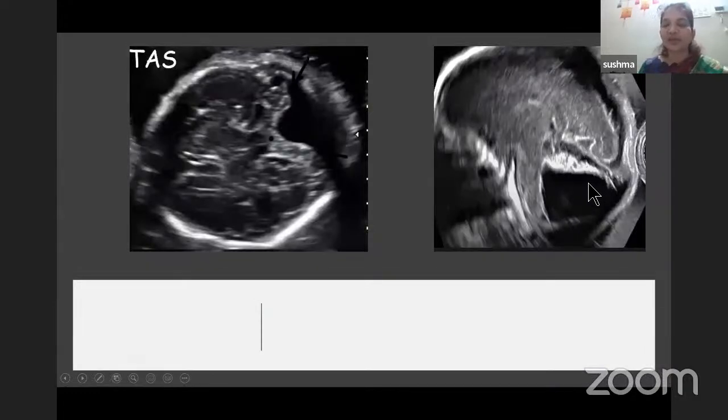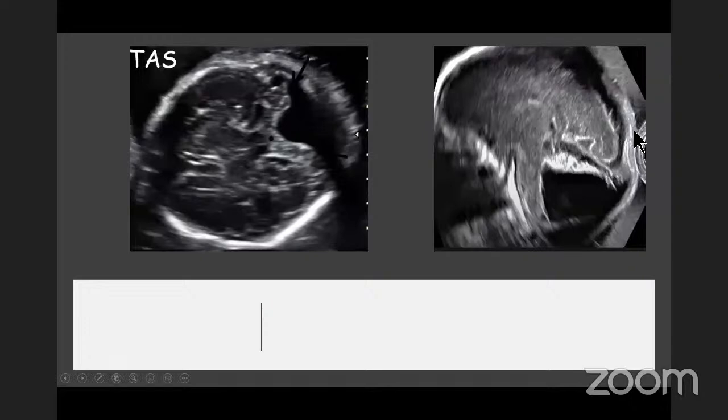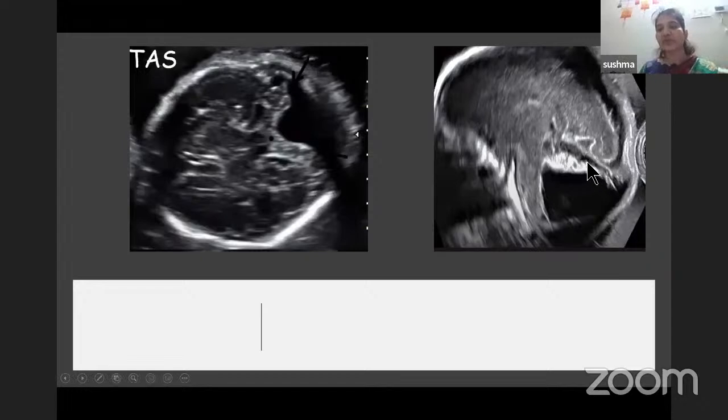I have already mentioned all the diagnoses in the first slide before I started these images. Vermis, by Dr. Alka Patil. Yeah, this is the vermis. Yes, that is true. The vermis is a very echogenic structure. Instead of being vertical, it is transversely placed because it is pushed by the fluid-filled content here. I'll give a few seconds if anyone wants to type the diagnosis.